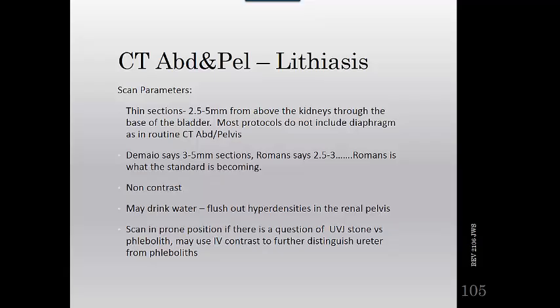But we're going to stick with Romans and say the standard is 2.5 to 3 millimeter sections through the kidneys, from above the kidneys through the base of the bladder. It's going to be non-contrast. Some protocols can have the patient drink water to flush out the hyperdensities in the renal pelvis.